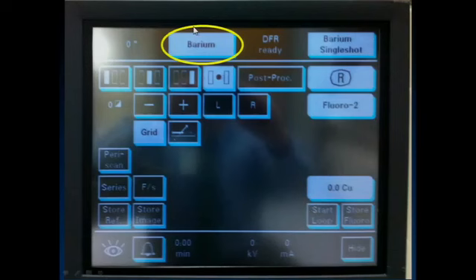This is the button that selects the type of contrast agent, and as you can imagine, when you hit that, it sets the kVp on the X-ray tube to match that well, which is why we don't want to go adjusting the kVp on a contrast study unless we absolutely need to, right?